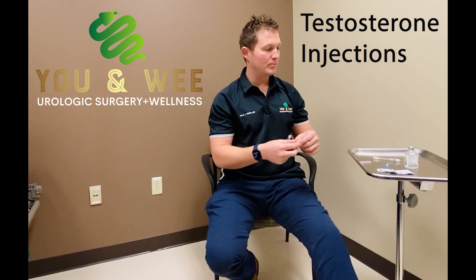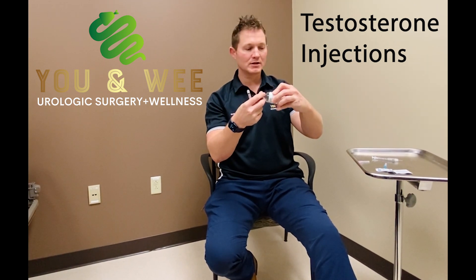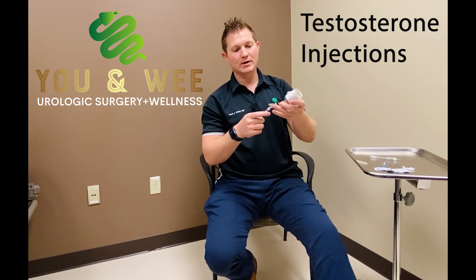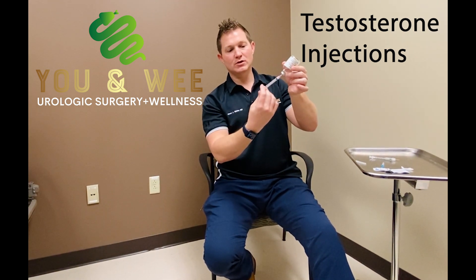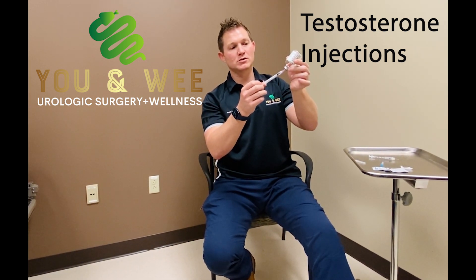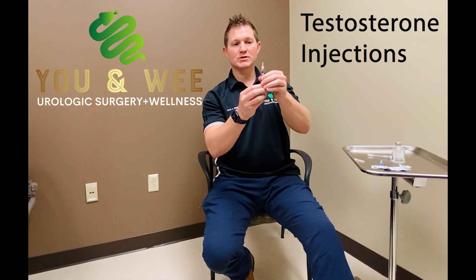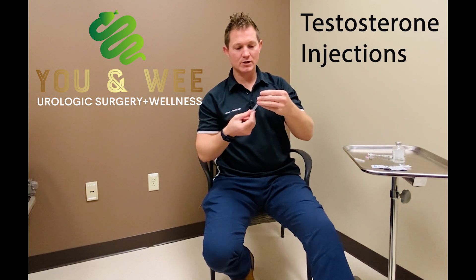First, take your alcohol prep pad and wipe off the top of the bottle of your medication. Your bottle may be a different size, but the process is the same. Using your 18-gauge needle — which is larger in diameter to make it easier to draw the medication — puncture the bottle. Push in to make sure all the air is out of the syringe, then pull back and draw up your dose, whether it's a half CC, one CC, or whatever your prescribed amount is. Flick any air bubbles to the top and squirt them out, since you don't want to inject air bubbles. Then switch to your new injection needle.